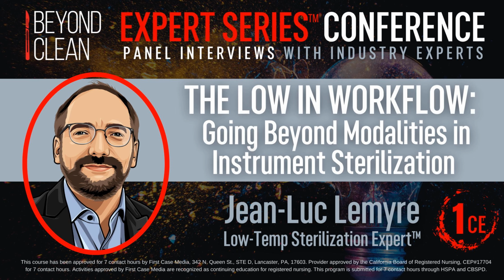Yeah, and so that's something to be careful about. With all the push and emphasis on efficiency and people trying to avoid using immediate use sterilization, there have been some pretty wacky attempts to run instruments through their low temp sterilizer just because it's faster. And so, yeah, let's be people of the book. Let's go back to our validation studies and make sure that both the sterilizer and the instrument say that sterilization method is appropriate. Are there any special considerations to be made regarding sterilizing implants in a low-temp sterilizer?